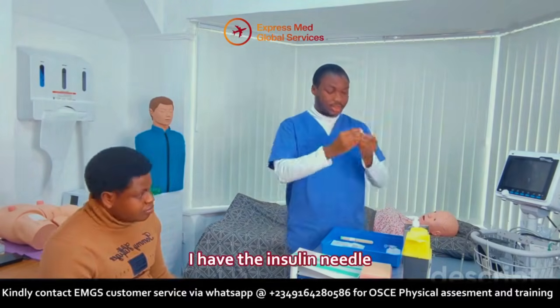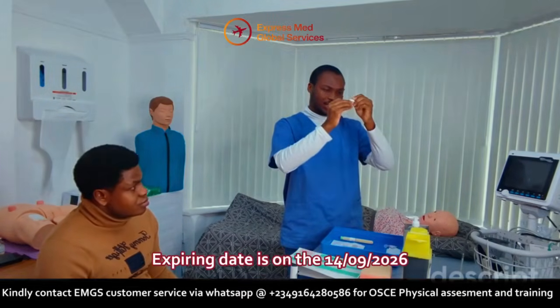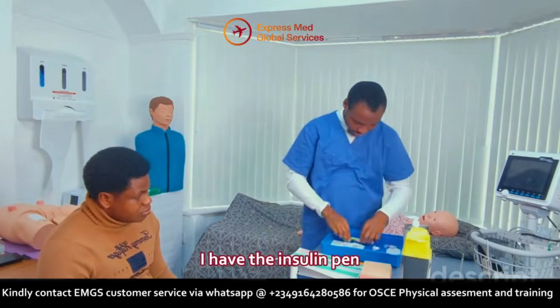I have the insulin needle. I can see that it's clean, intact, not broken. The expiry date is on the 14/9/2026. I'm happy to use this. I have the insulin pen.